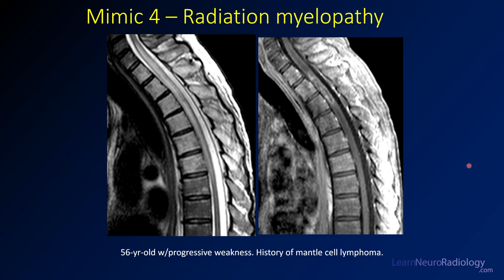Mimic number four is radiation myelopathy. This was a 56-year-old with progressive weakness and a history of mantle cell lymphoma. In the upper thoracic spine, there's a long-segment T2 abnormality from about C6-C7 through the mid-thoracic spine to roughly T6. On post-contrast imaging, it looks like many of the tumors from the previous lecture — broken enhancement, maybe some central necrosis — but unlike those tumors, there's not a lot of expansion or mass effect.